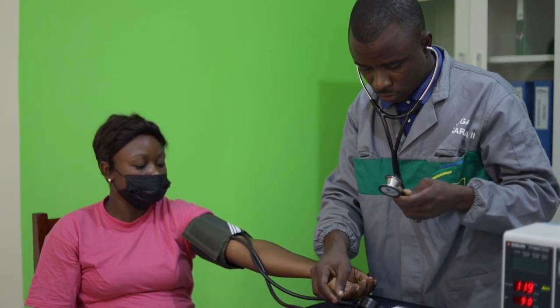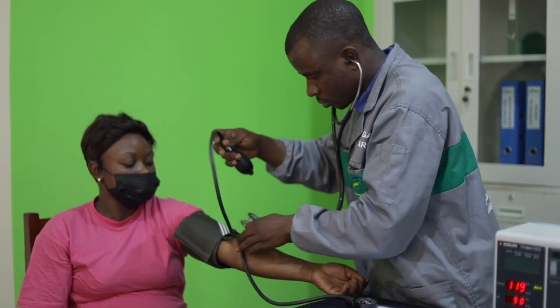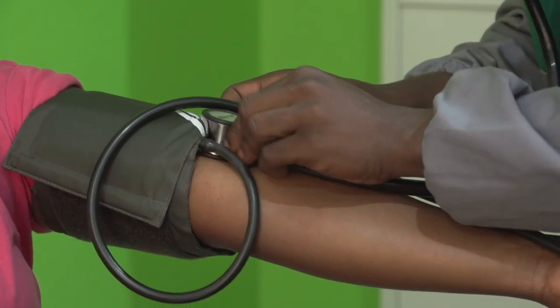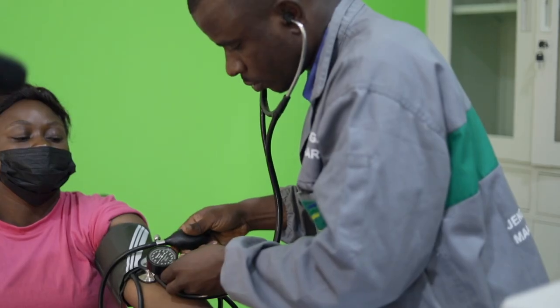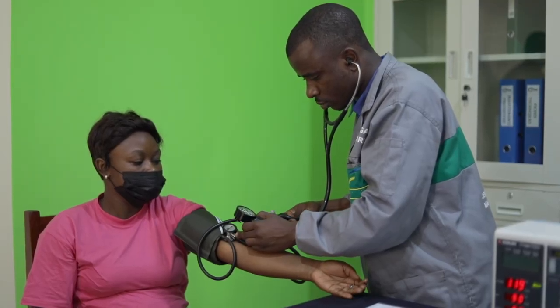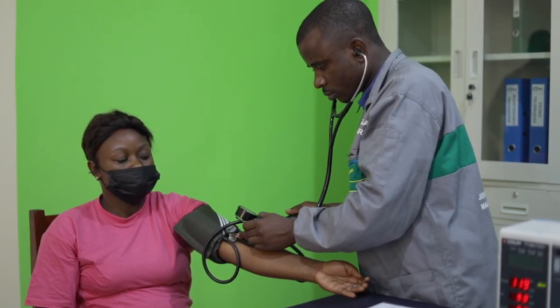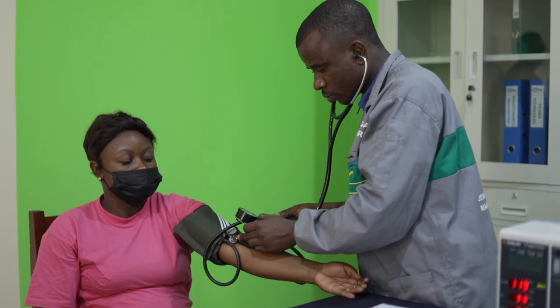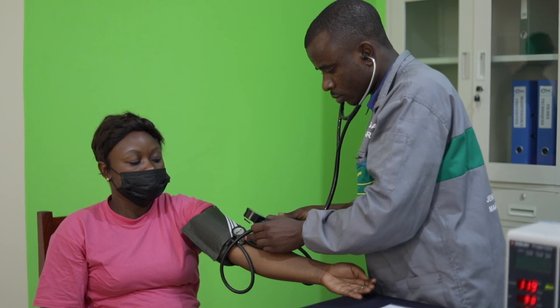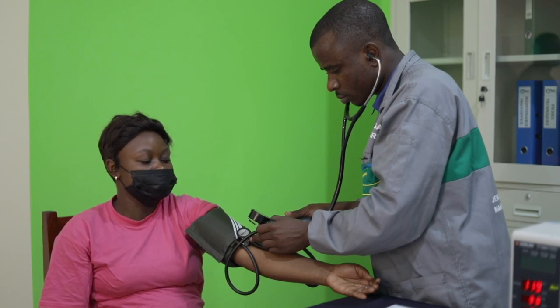Deuxième méthode : avec un tensiomètre manuel et un stéthoscope, on mesure manuellement les valeurs des pressions artérielles. On place le tensiomètre manuel autour du bras et le stéthoscope sur l'artère. On gonfle le brassard et on écoute l'apparition d'un son correspondant au passage du sang dans les artères. On continue de gonfler jusqu'à ne plus entendre de sons — à ce moment-là, l'artère est comprimée. On dégonfle progressivement le brassard et on mémorise la pression au moment exact où un son est de nouveau audible : il s'agit de la pression systolique. Les bruits s'arrêtent lorsque la pression exercée par le brassard devient inférieure à celle du sang dans l'artère — on mémorise ici la pression diastolique.